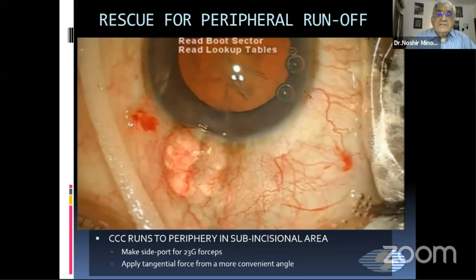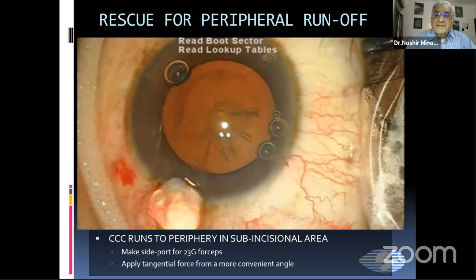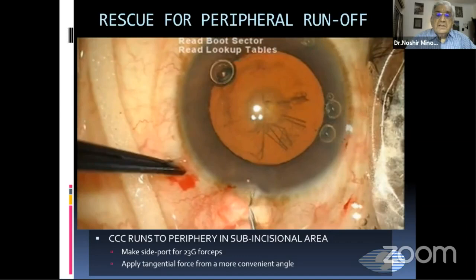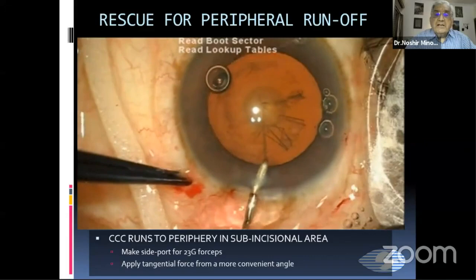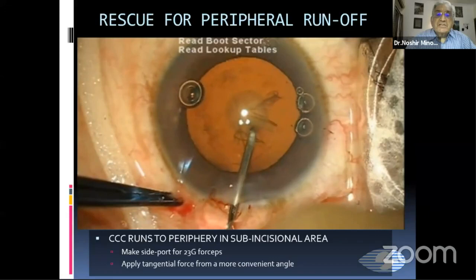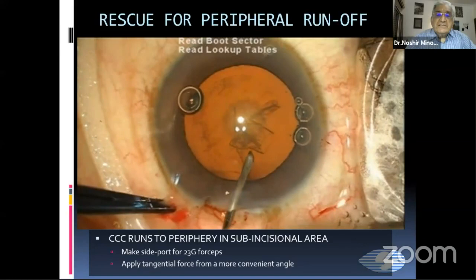Now we can see the edge quite well here, and we see that it's pointing towards the periphery. So I inject viscoelastic again and then try again with a needle centripetally—I try to guide this flap centripetally with my needle. But again I find it's not going; the capsulorhexis is again moving to the periphery and not coming to the center. So I abandon this.